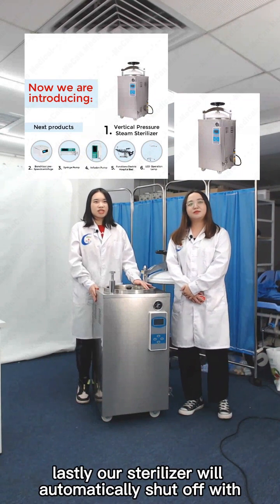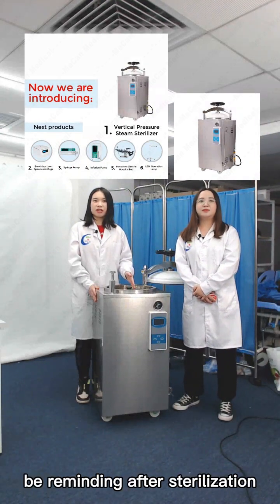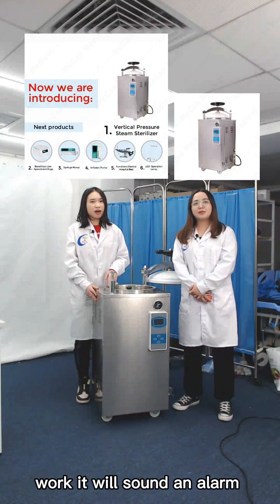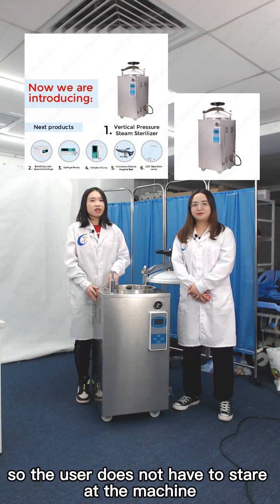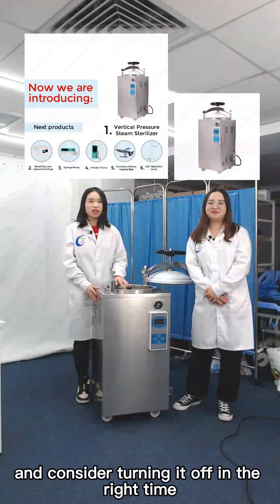Lastly, our sterilizer will automatically shut off with a beep reminder after sterilization. When the sterilizer completes its work, it will sound a beep alarm, so the user does not have to stare at the machine and worry about turning it off at the right time.